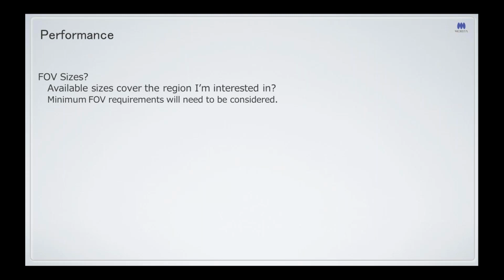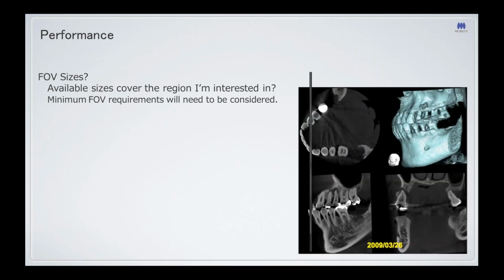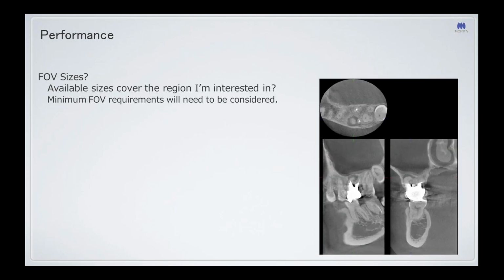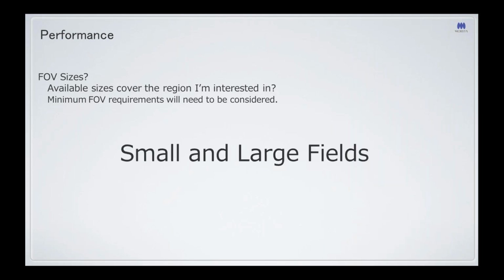And if you are a multi-practice institute, you may also want the variety. You may want to go from the very small to the very large. In fact, you may even want to go beyond that, depending on the surgeries that you want to perform at your clinic. So take a look at your machine. Does it give you a variety of different fields of view, from as small as 4x4 and 4x8 to as large as 8x8 and 10x8.